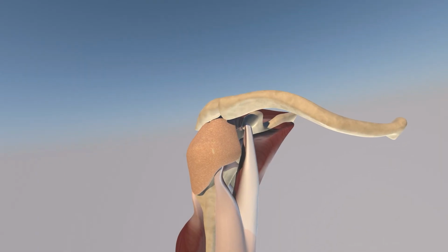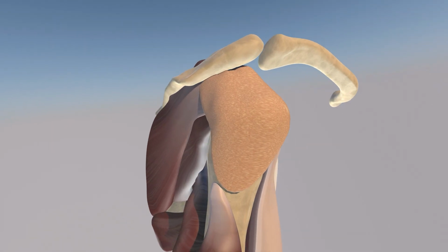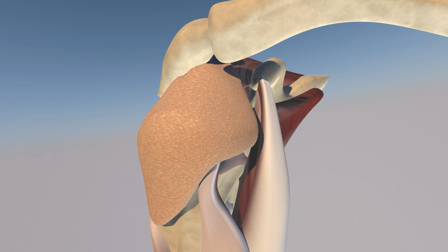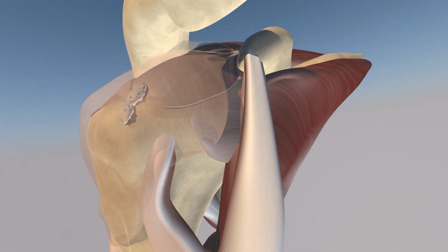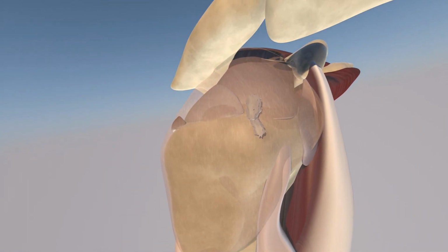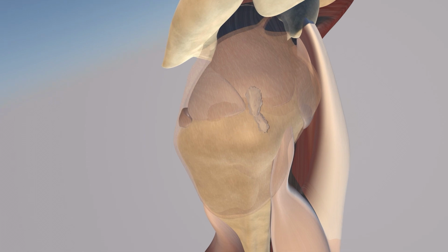We're going to go over this patient who had calcific bodies in the subdeltoid bursa. Here we're just looking at a normal subdeltoid bursa overlying much of the rotator cuff. And here you can appreciate these two calcific bodies within the subdeltoid bursa, essentially at the insertion of the supraspinatus tendon and then somewhat overlying the dependent portion of the subdeltoid bursa, going somewhat lateral to the greater tuberosity. And actually in this depiction, the calcific bodies are a little bit medial as compared to what we see in the actual ultrasound case.